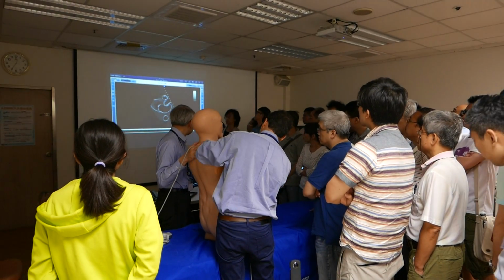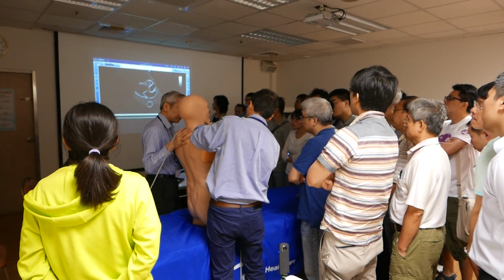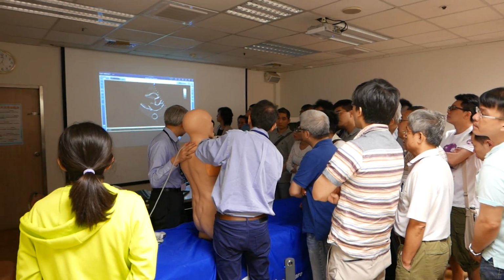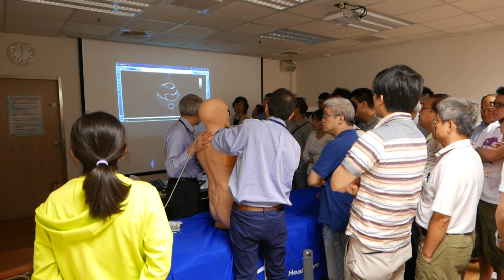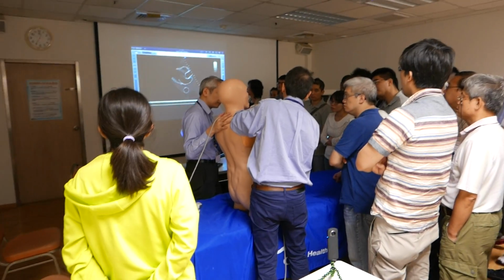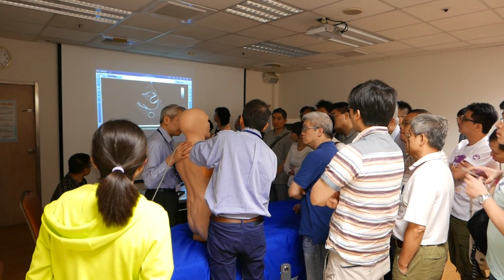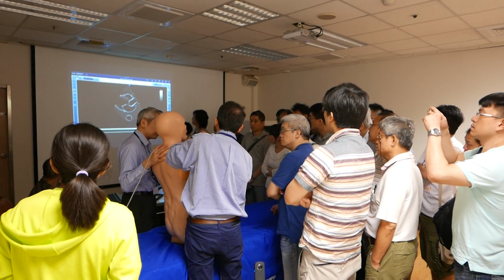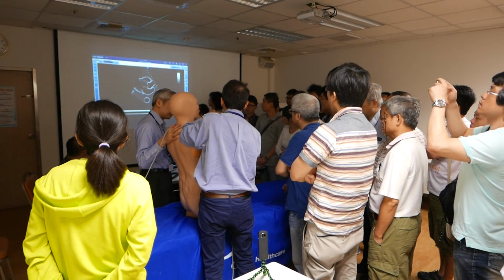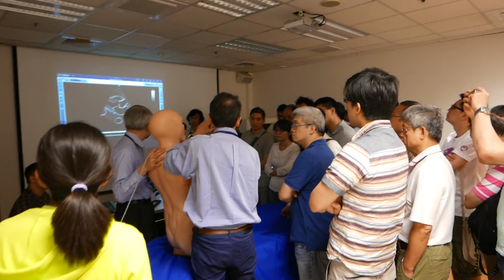I place my probe on the left side of the sternum, roughly at the third or fourth intercostal space. You will see that in an ICU patient, it is usually easier to obtain the view from the fourth intercostal space. You are trying to obtain a view where the ventricular wall will be perpendicular to your M mode line, so that you can make measurements that are orthogonal to the walls, in order not to artificially increase the size of the cavity and the thickness of the wall.